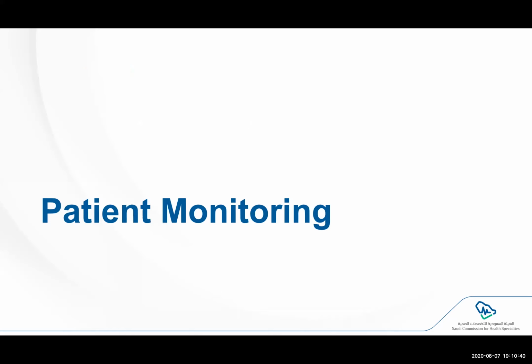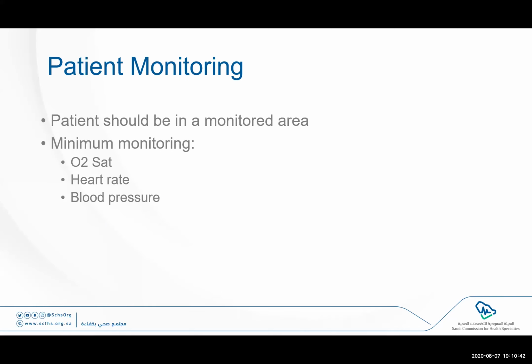If you decide to apply the helmet, the patient needs to be in a monitored area with a minimum monitoring of oxygen saturation, heart rate, and blood pressure. Currently, in our institution, the helmet is only applied in critical care settings.